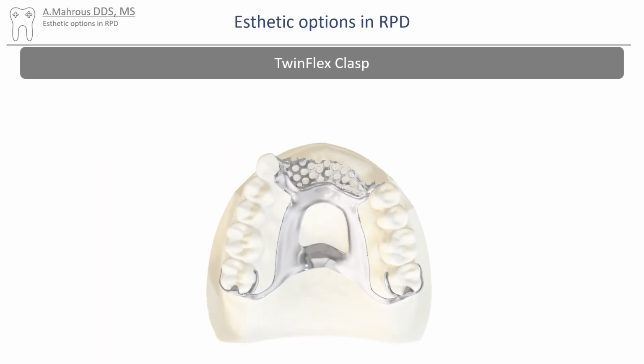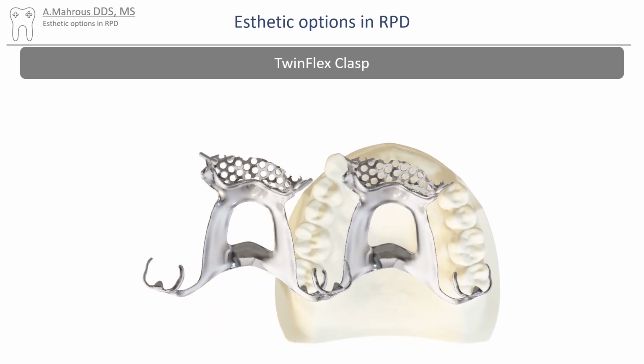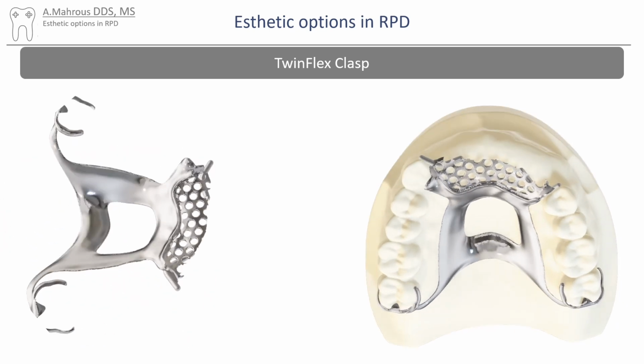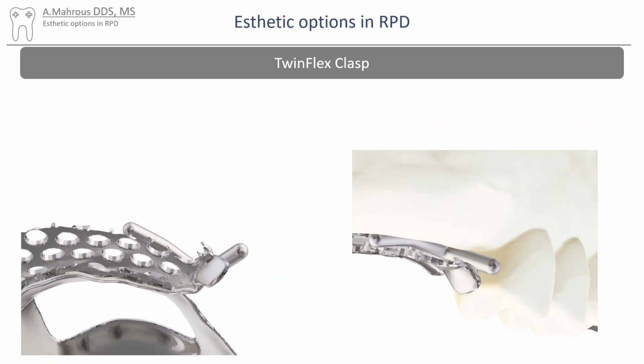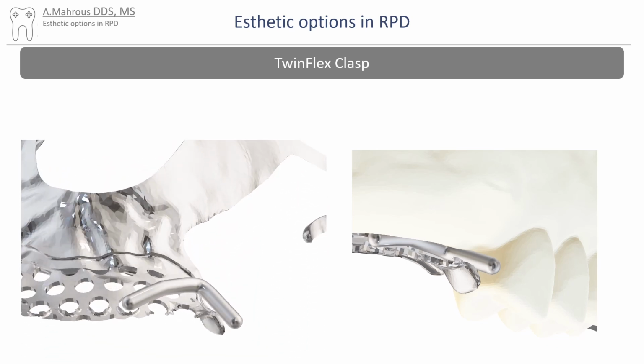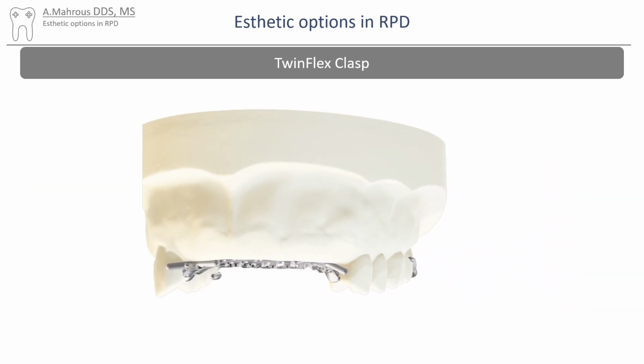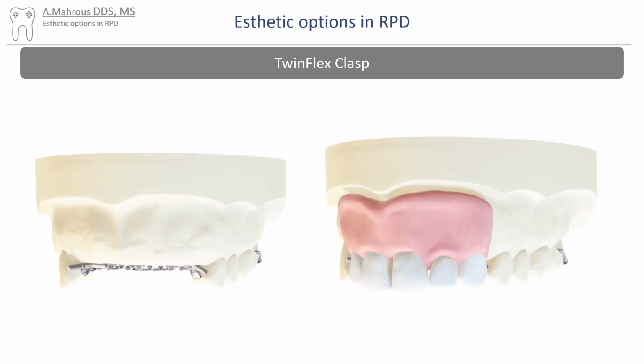But just to make sure you understand it, we're also going to show an animation of how that framework looks. As you can see here, if we take that framework and flip it over, you can see that twin flex wrought wire clasp engaging underneath the proximal plate. And if you flip it to the intaglio, you can see it being soldered onto that meshwork on the inside. When the teeth are placed onto the framework, you can see that that clasp tip is hidden from view by the tooth in front of it.